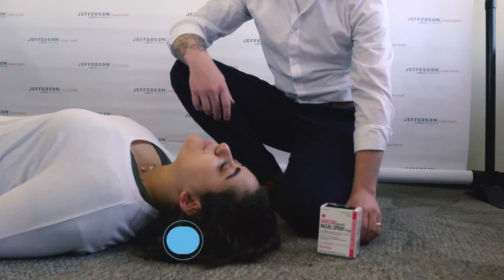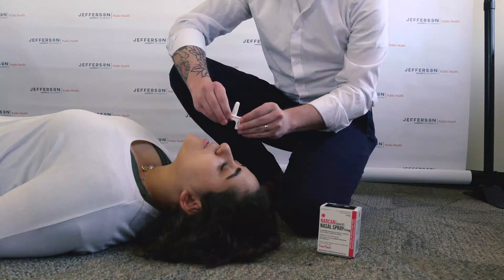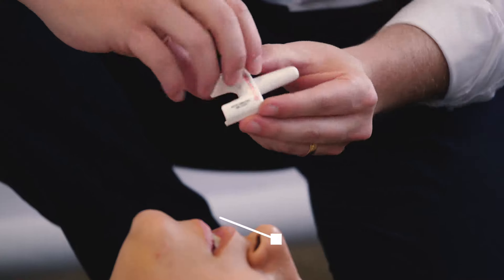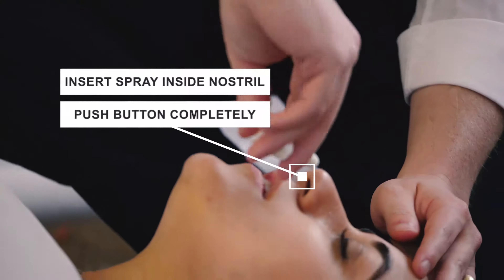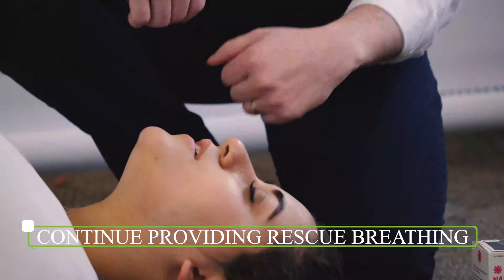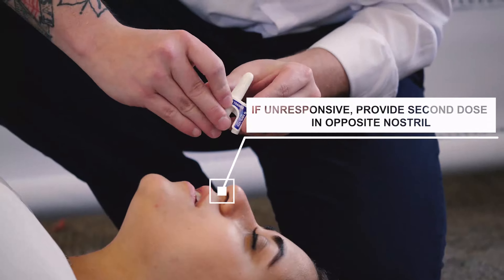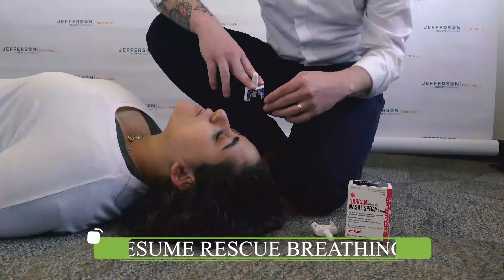Once you start rescue breathing, you will need to administer naloxone. Multiple doses of Narcan may be needed to reverse the overdose. To administer the nasal spray, remove the product from the box, insert the spray inside the nostril as far as possible, and press the middle button until completely pushed in, then remove from the nostril. Once Narcan has been administered, continue providing rescue breathing. If the individual has still not been responsive after two to three minutes, provide a second dose of naloxone in the opposite nostril and resume rescue breathing until first responders arrive.